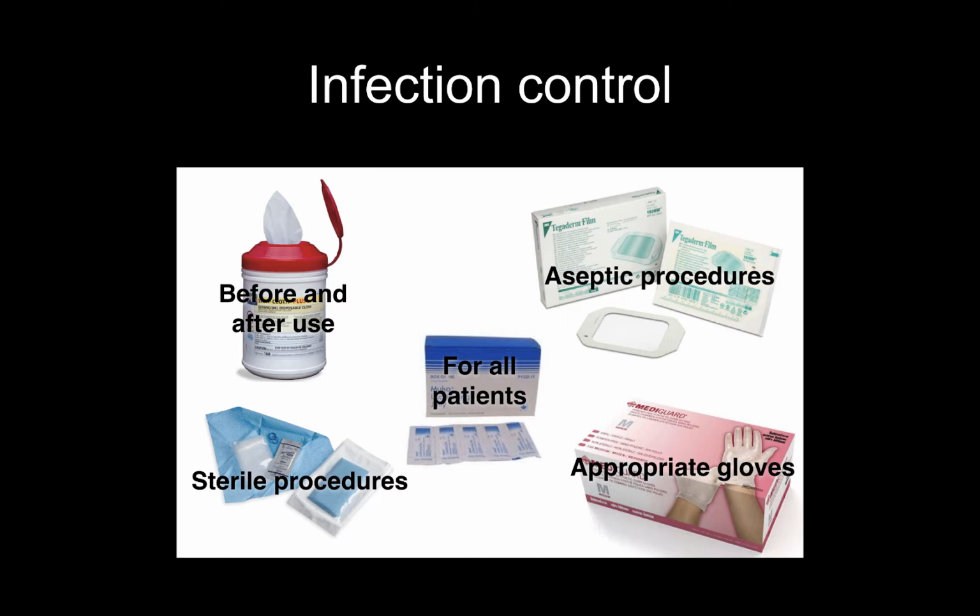Ultrasound gel bottles that are shared from patient to patient have been associated in a number of studies with nosocomial pathogen transmission. So I think it's really best practice to use disposable gel sachets for every patient. And the muco-lubricating jelly sachets are perfect for this purpose. They're essentially the same as ultrasound gel and they're readily available on the wards.